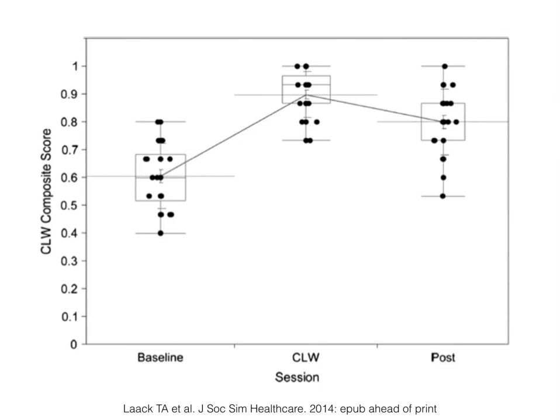instructional methods. LAC looked at education and simulation-based education to train people how to do central lines, and this was their central line workshop. So they took people with a baseline, they taught them, they used simulation-based education in a standardized workshop format. People got better, but then after time they kind of fell off. So you can see here that in the baseline they got better than that with the session, and then after a session they were still better than when they started, but not as good as right after the session. So there was some degradation of skill, which they kind of bring up in their article.